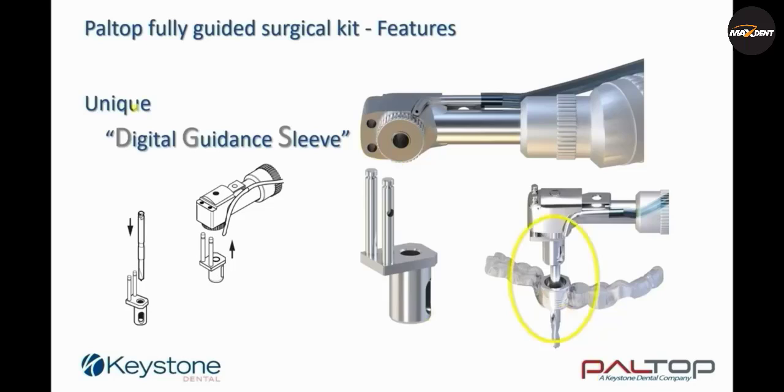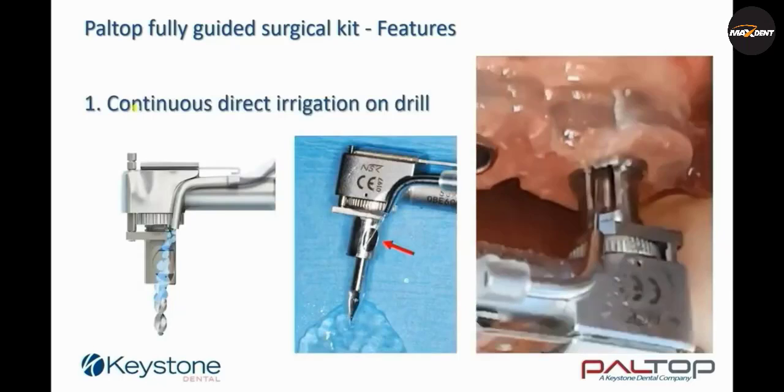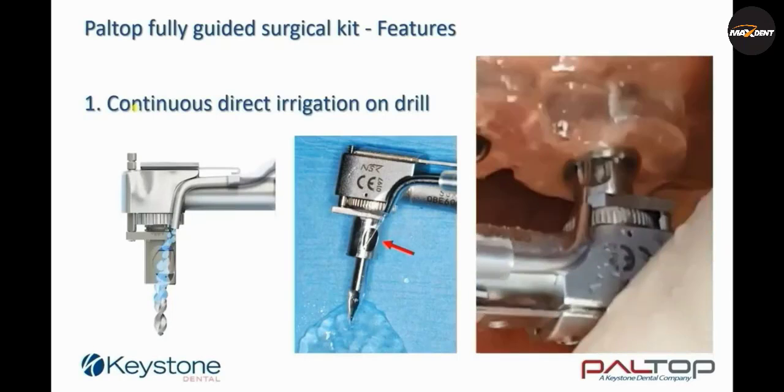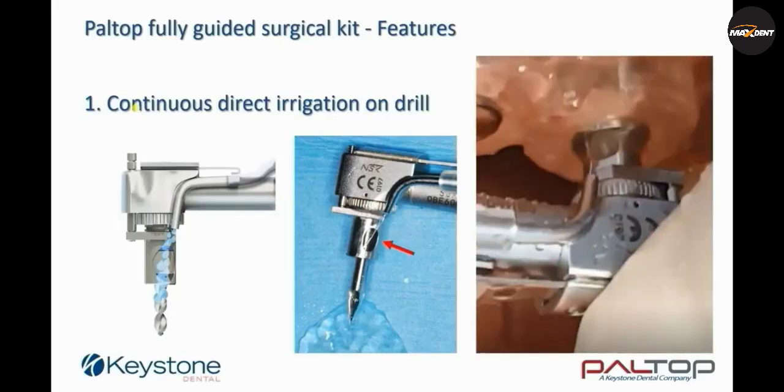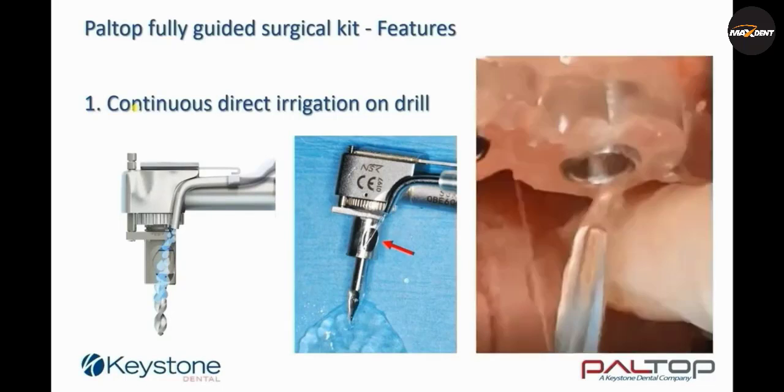The DGS guides the contra-angle through the surgical guide sleeve to accurately position the drills in accordance with the virtual planning.